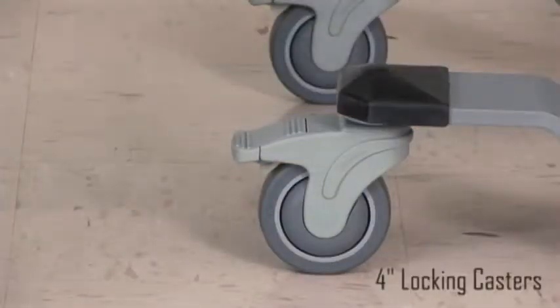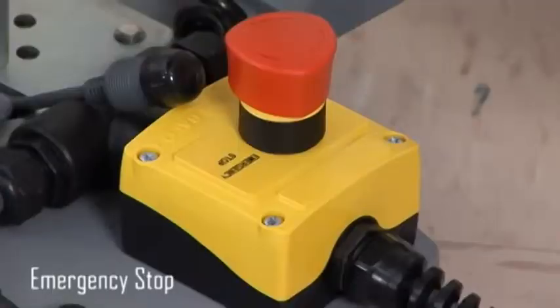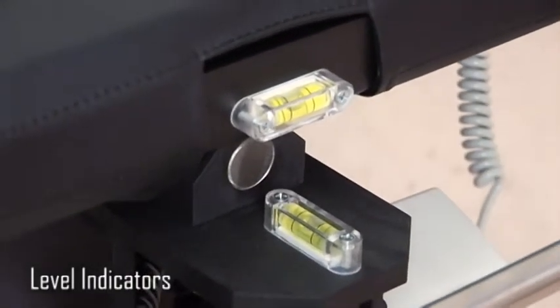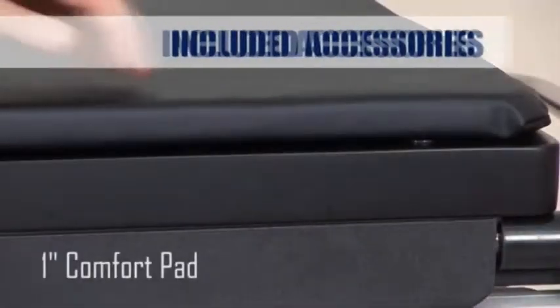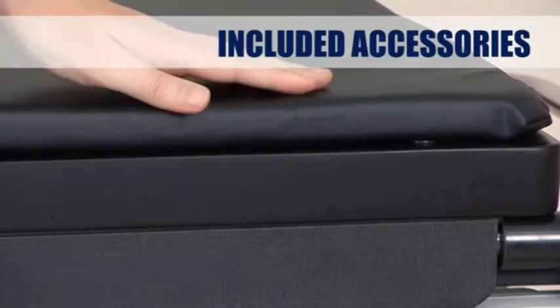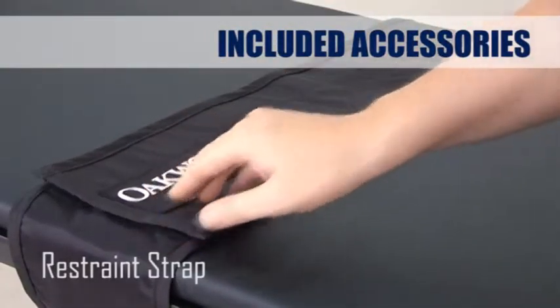Easy rolling 4 inch locking casters securely lock the table in place. An easy to access emergency stop button is engaged by stepping on it, killing all power to the table. Two level indicators help to locate horizontal. A 1 inch comfort pad that attaches with Velcro is included with the table, along with a very comfortable restraint strap that securely holds the patient in place.